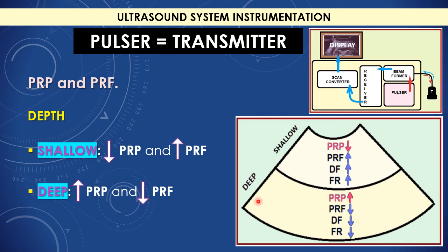All right. Also remember one thing here: the PRF, DF, and FR, all of them are sharing the letter F. I noticed this. It might help also to put them in one group.